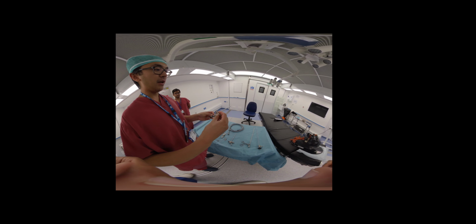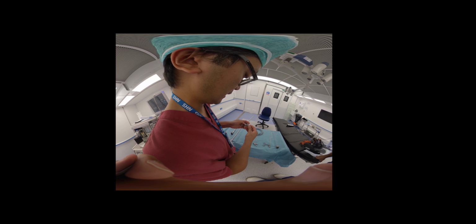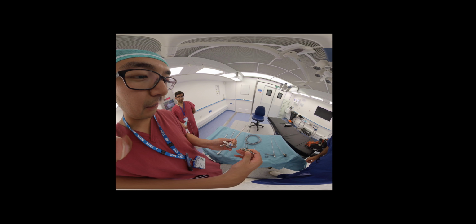So the first thing is the light prism. This is a prism where you attach the light lead, the light goes in through here, there's a prism, and it shines the light down the scope. There are different gradients of where you can insert it. So basically that's fully in, halfway in, and then out.